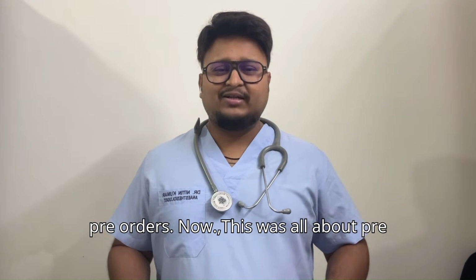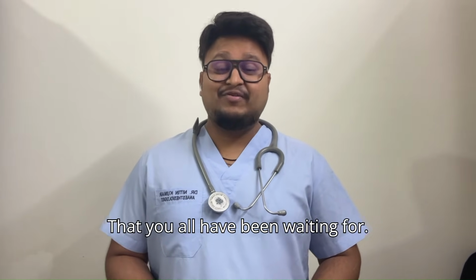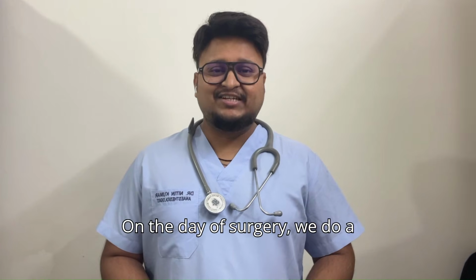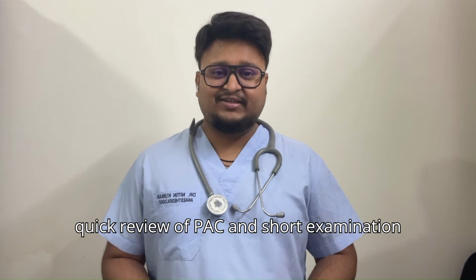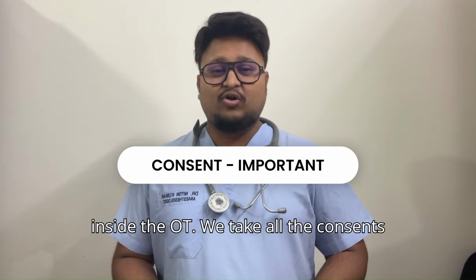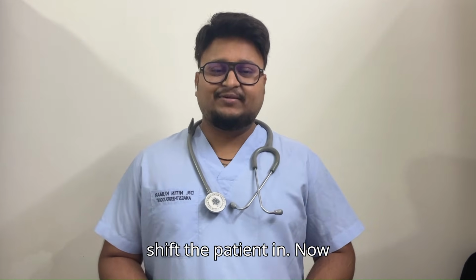Now this was all about pre-op part. Now let's go to intra-op part that you all have been waiting for. On the day of surgery, we do a quick review of PAC and a short examination of the patient before taking the patient inside the OT. We take all the consents necessary for surgery and anesthesia and shift the patient in.